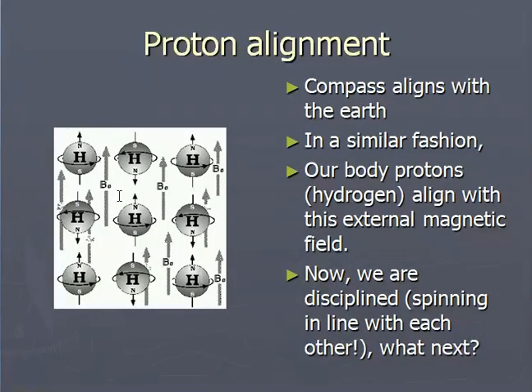In this picture you will see how the protons get aligned. Compass aligns with the earth. In a similar fashion, our body protons, hydrogen, align with this external magnetic field. Now we are disciplined, spinning in line with each other. And what will happen next?